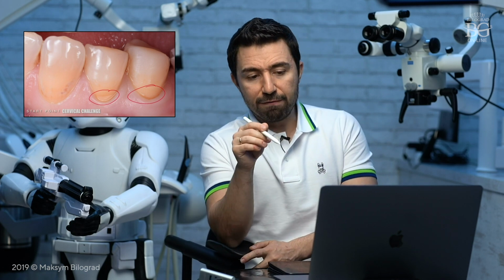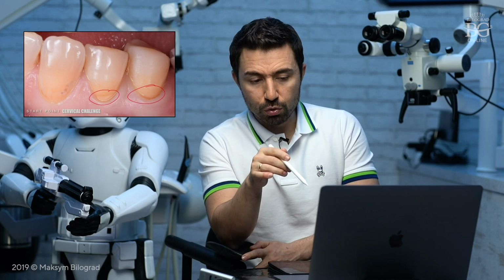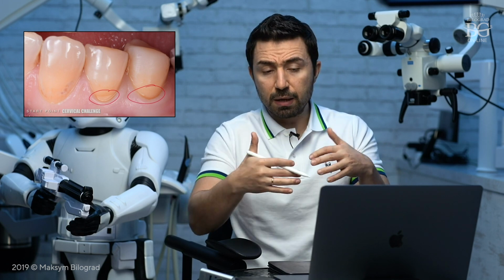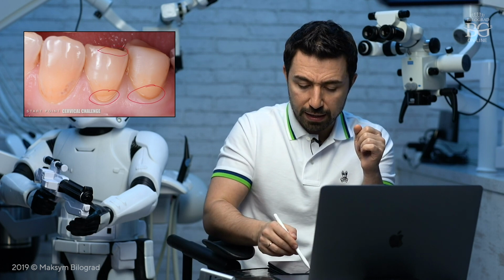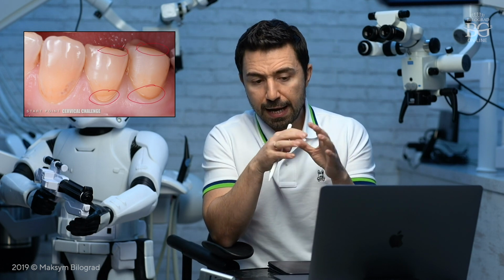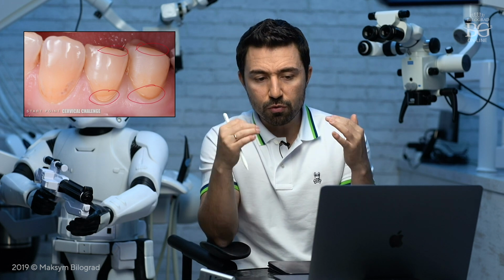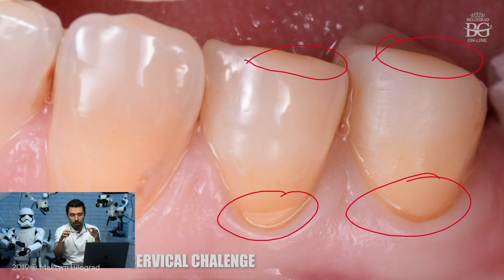Which means these teeth also have lateral occlusal loads, and if you would just do that type of restoration, let's say I combine ceramic and composite, the composite may not survive because the abfraction in that case is caused by poor occlusion, okay? This case is part of a full mouth reconstruction case. In this case, we redesigned occlusion for all the patient's teeth, and we reduced lateral occlusal loads for those teeth.